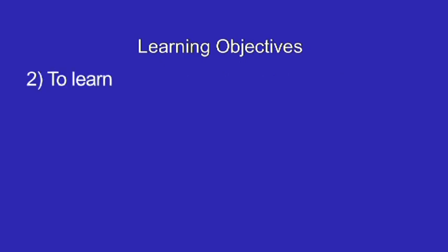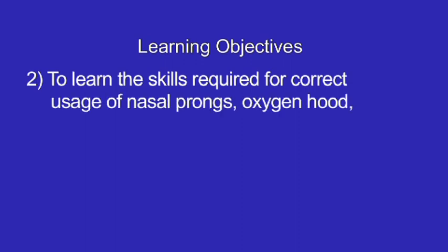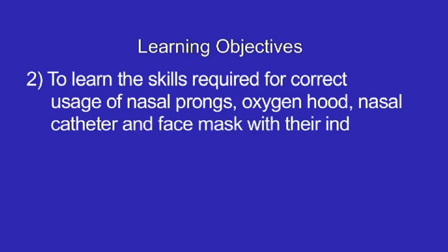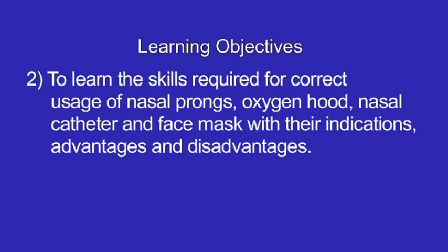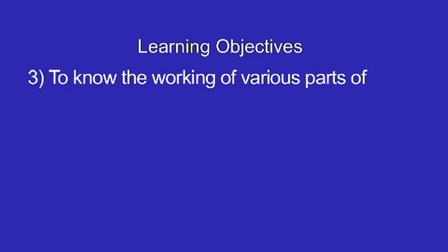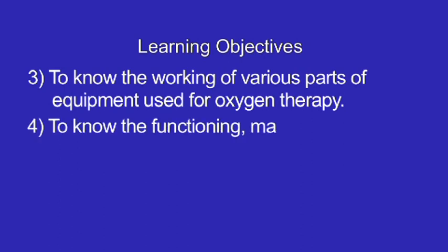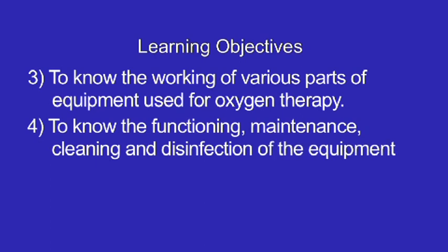To learn the skills required for correct usage of nasal prongs, oxygen hood, nasal catheter and face mask with their indications, advantages and disadvantages. To know the working of various parts of equipment used for oxygen therapy. To know the functioning, maintenance, cleaning and disinfection of the equipments.